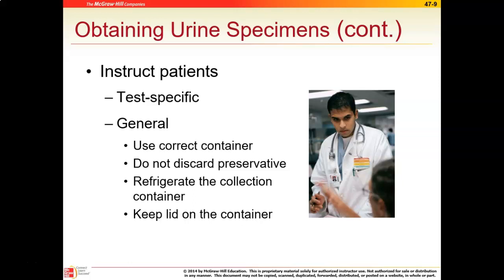When you're doing these tests, you can refrigerate the collection container in between to prevent the growth of bacteria until you can actually get it to the lab, okay? And we're always going to keep the lid on the container as much as possible.